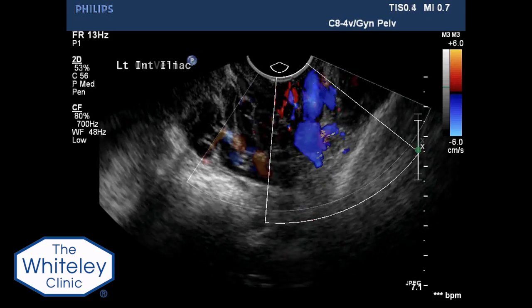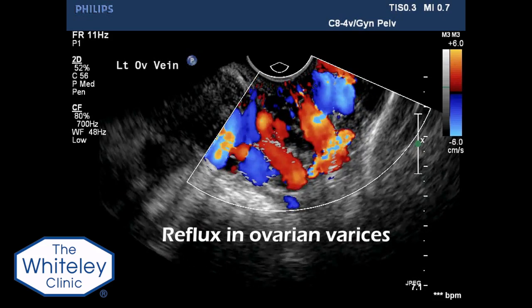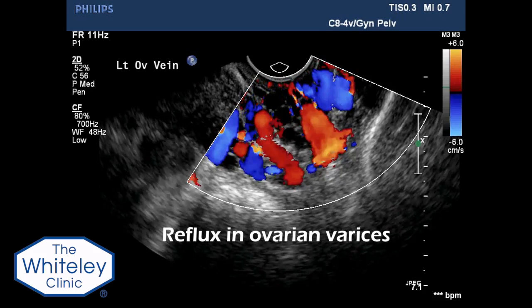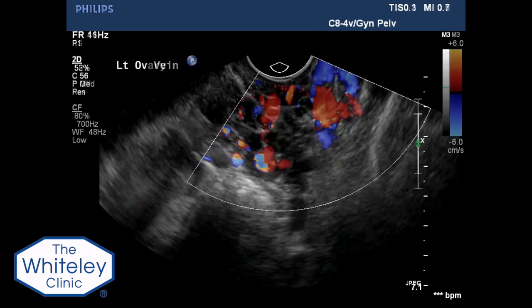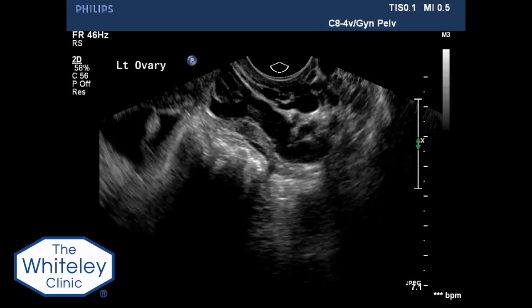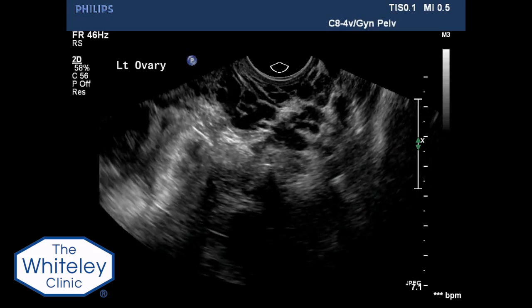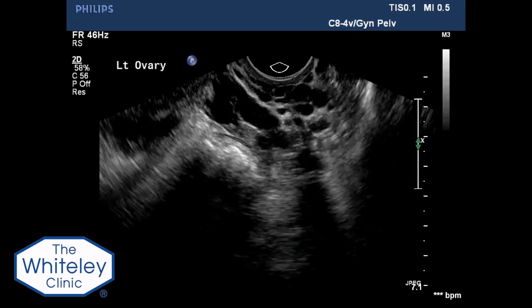As the transducer is moved more medially, gross reflux can be seen in the left ovarian vein varices, and the left ovarian vein can be seen traversing the left ovary.